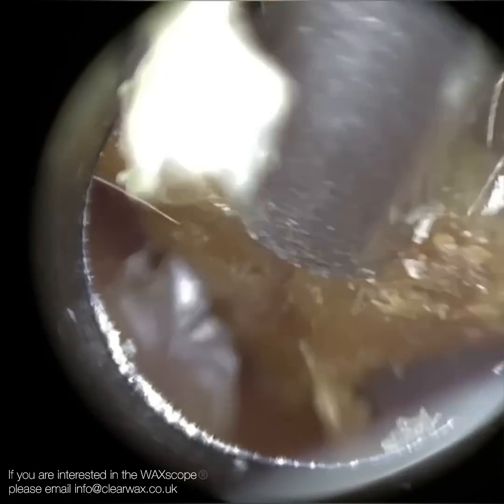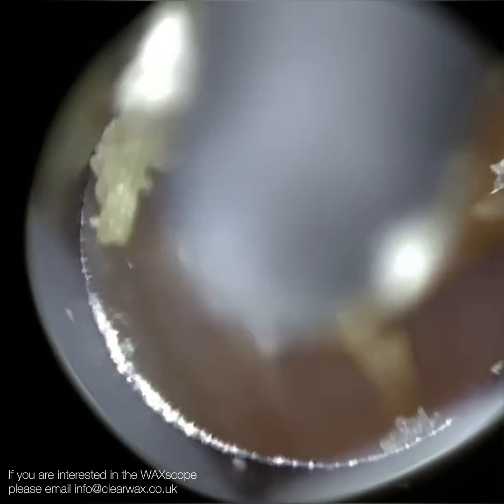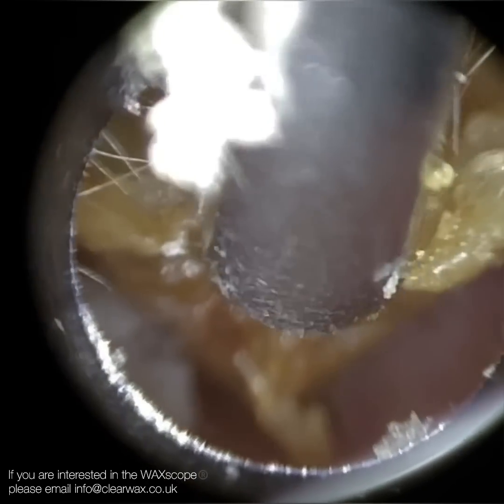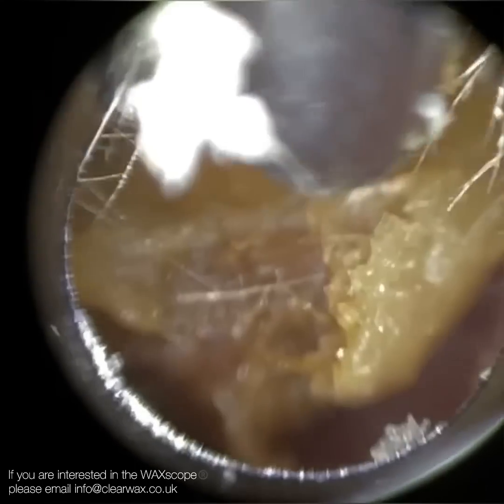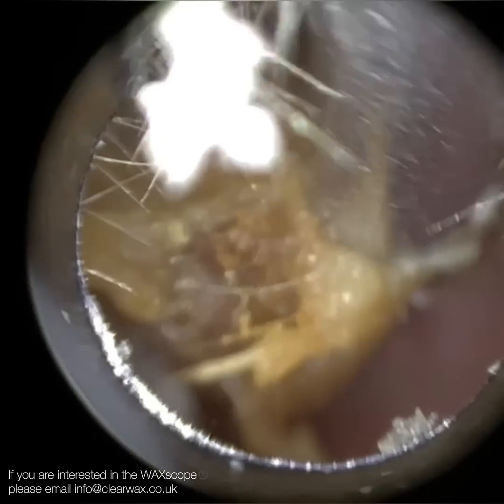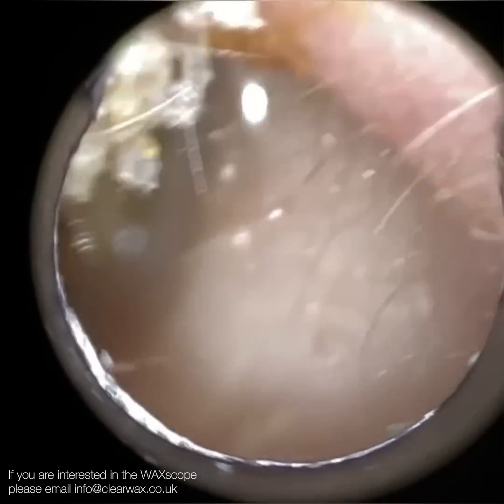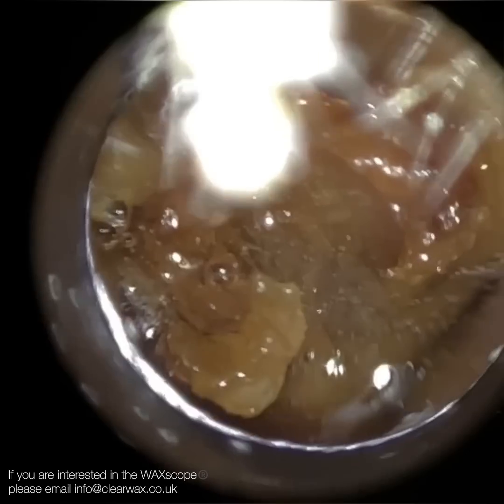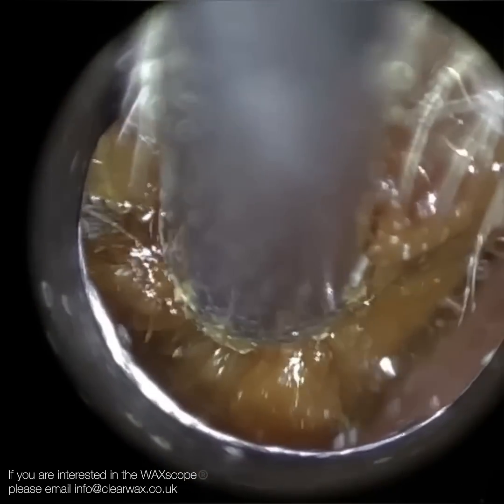On this side I've removed the majority of the wax, but some was left in the anterior recess. That's where the endoscope really excels — you can't compete with an endoscope for removing wax from an anterior recess. I was watching a video of a prominent ENT surgeon who performs complex middle ear surgery, including a stapedectomy.